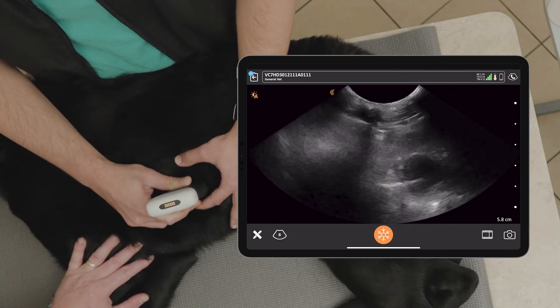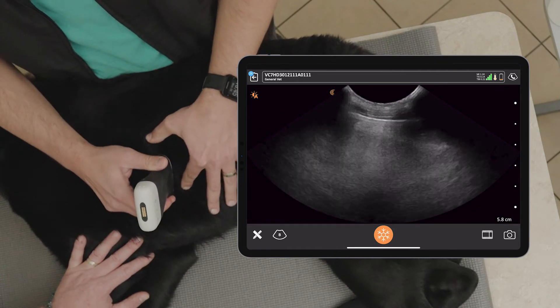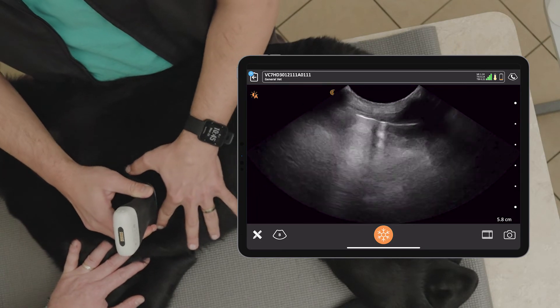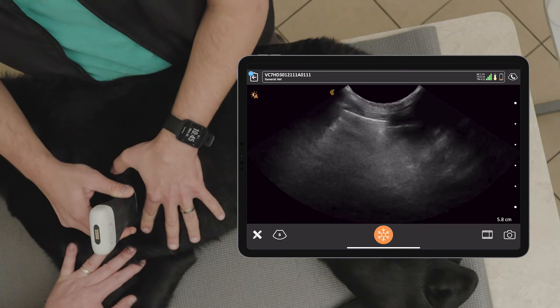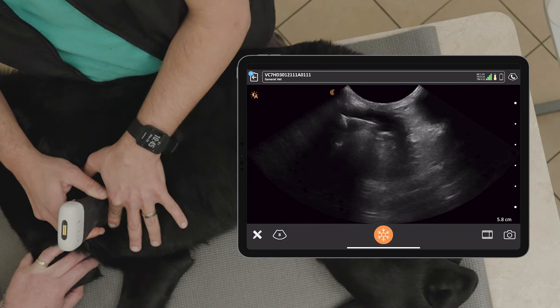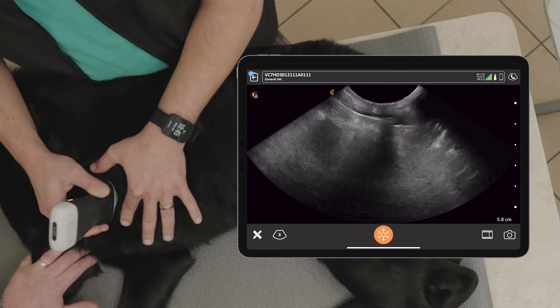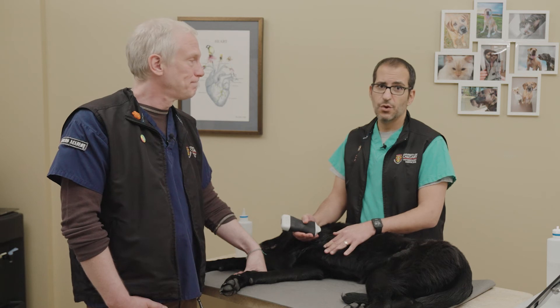Or if we want to look for both lung pathology and pleural effusion, we can turn the probe parallel as Serge did there. We want to make sure we check that ventral lung region, scanning up and down in between each rib space from the pericardiodiaphragmatic window up to the thoracic inlet cranially. So we've done a nice scan of the dorsal, middle, and ventral third of the lung surface looking for increased B lines or lung pathology. That's how we look for lung pathology.